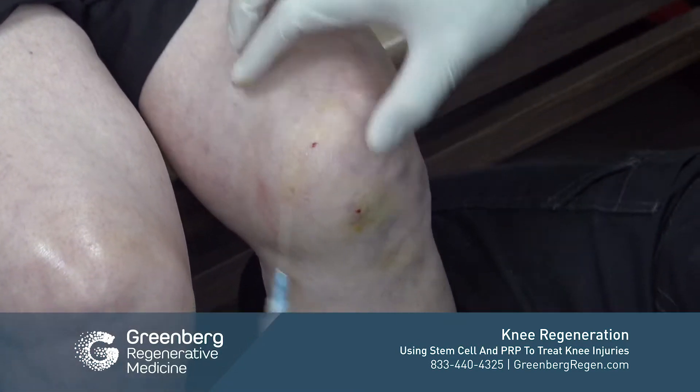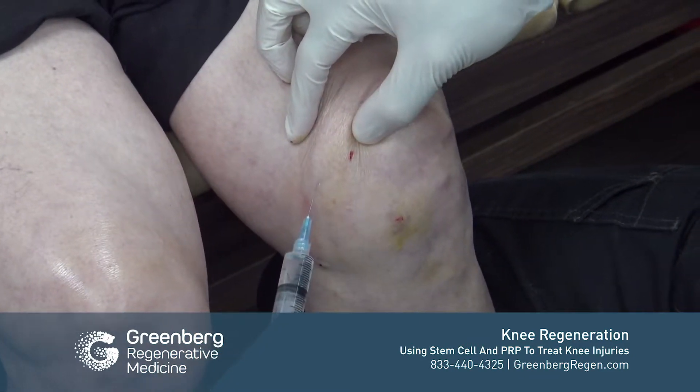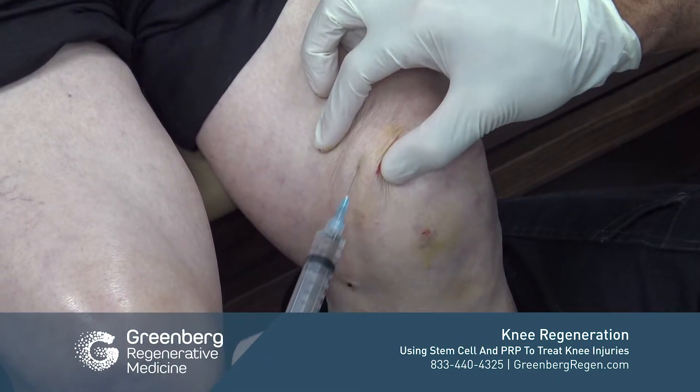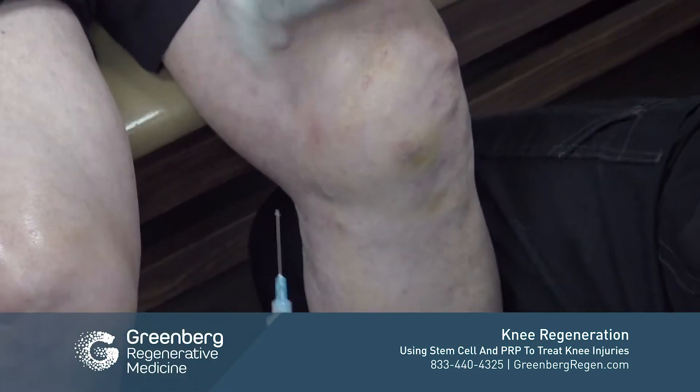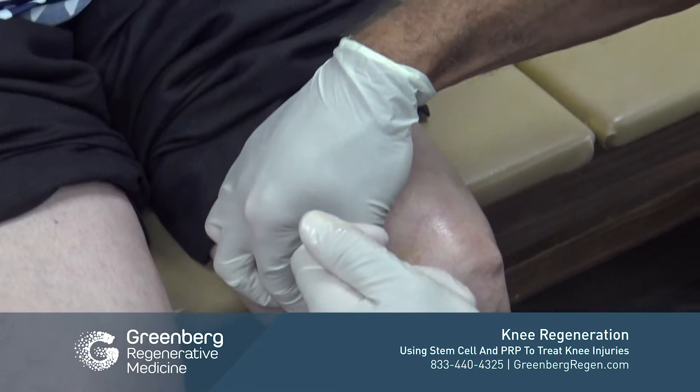This injection is to help where we're going to enter into the knee to deposit our materials. It's fortunately not very uncomfortable, but very beneficial for the patient.